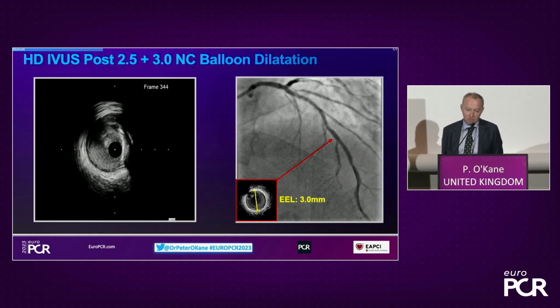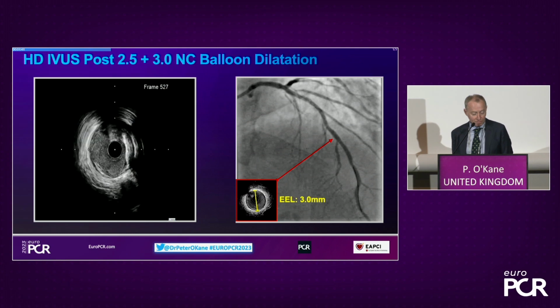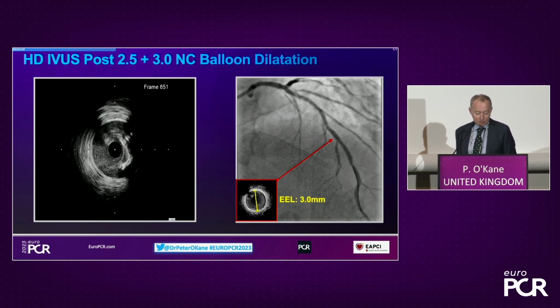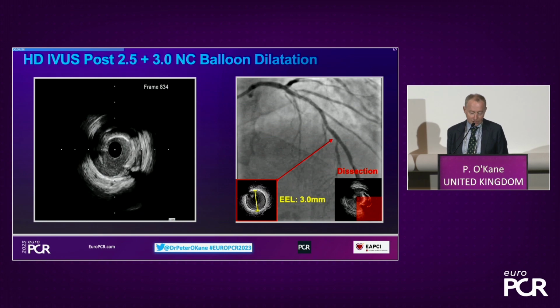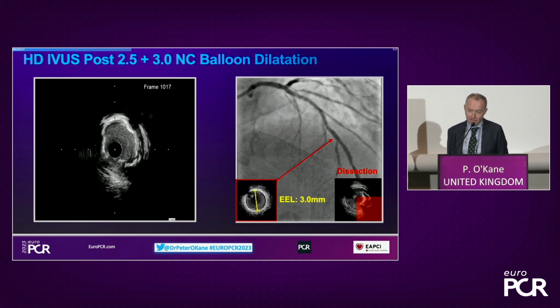Again, we just go through the same setup as we would before. So we make some measurements distally. It's around the same diameter. It can get bigger, of course, over time when you dilate the lesion. And as that IVUS starts to pull back, you can start to appreciate there is some dissection that you see in there at sort of 5 o'clock. And there's this disruption in this plaque. The lumen generally here is bigger, so the balloons have had an effect.